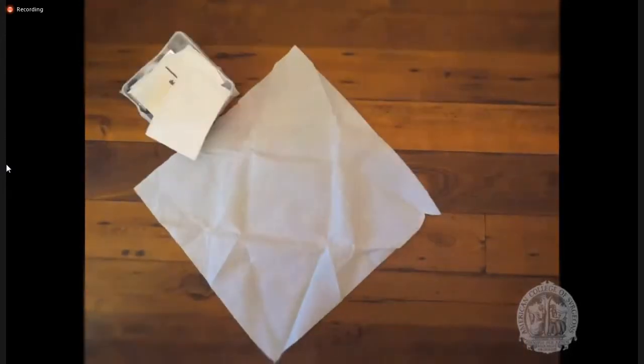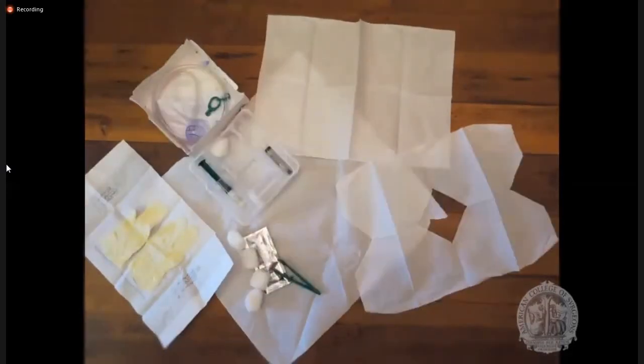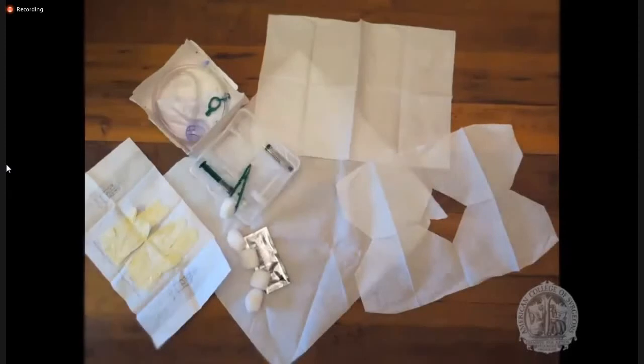Most institutions use commercially available catheter insertion kits that contain all the necessary items you'll need for catheter insertion. In that case, all you'll need to do is look on the outside of the box and choose the appropriate size catheter for your patient. 16 or 18 French is typical in an adult. Let's look at a kit that contains everything you'll need. Sometimes the catheter is packaged separately, as with this kit, so make sure you're choosing the right kit.